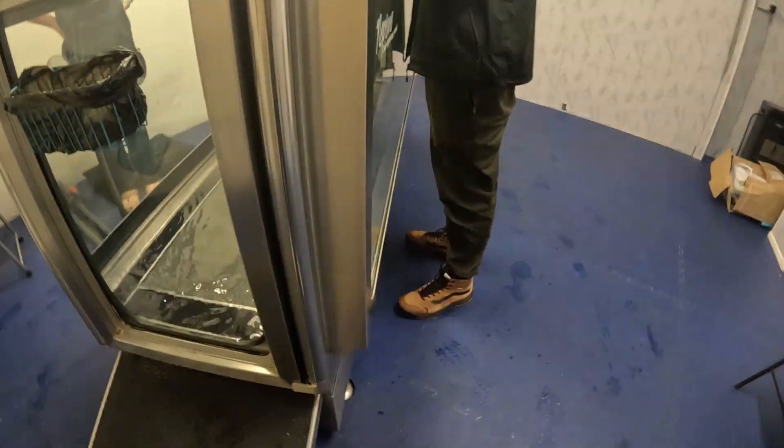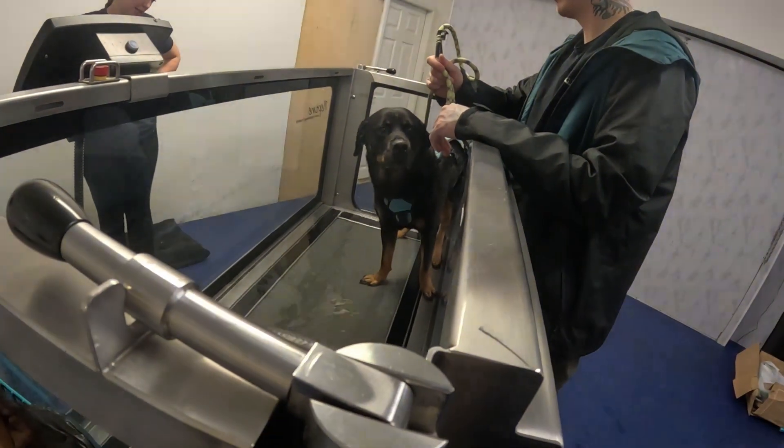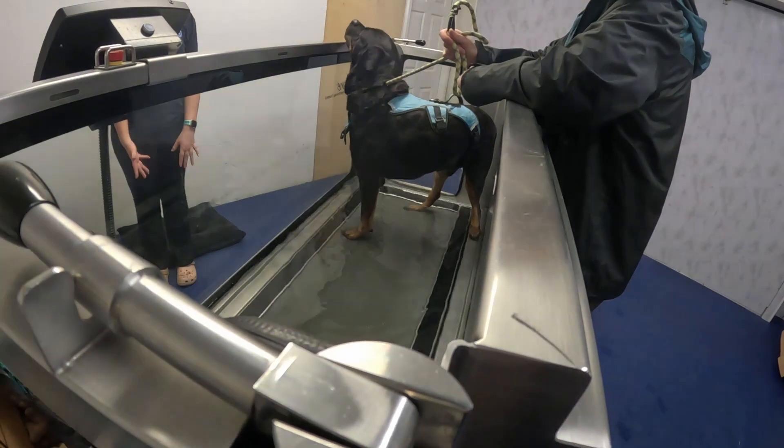So, the water's heated. It's between 29 and 32 degrees for therapeutic practice. And we tend to, with the water level, we tend to take it, if we can, we cover the affected area. So, with his knee, we can.